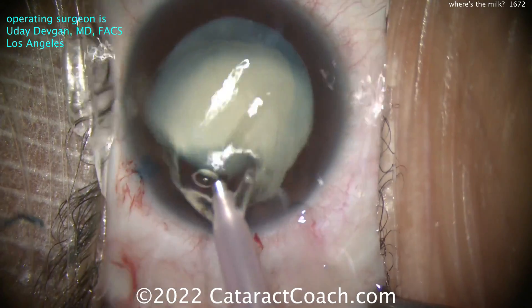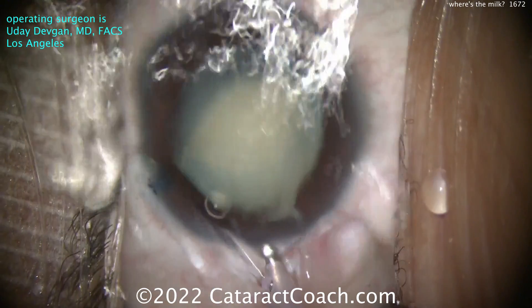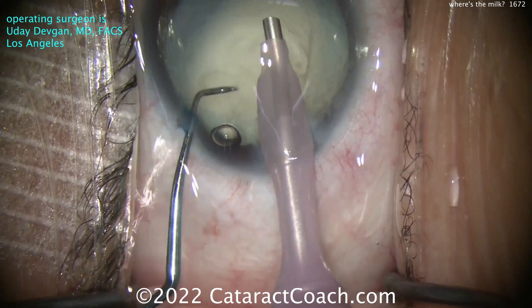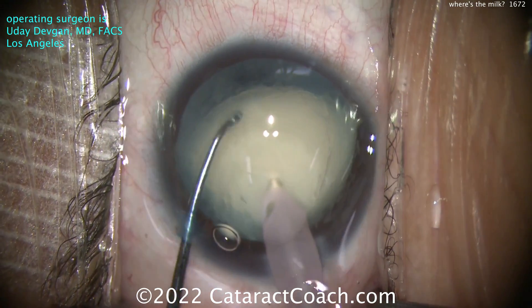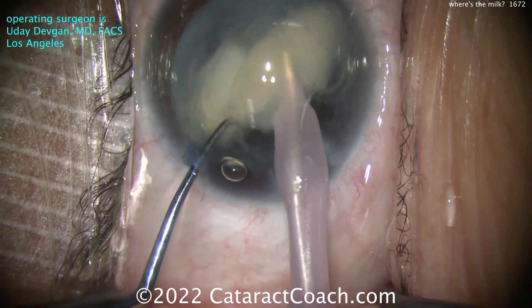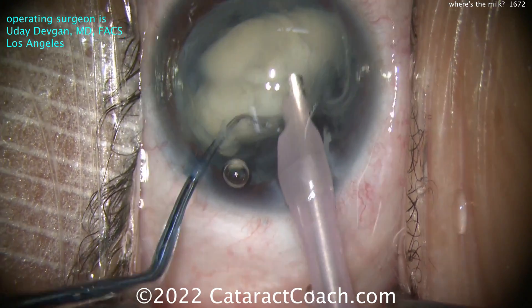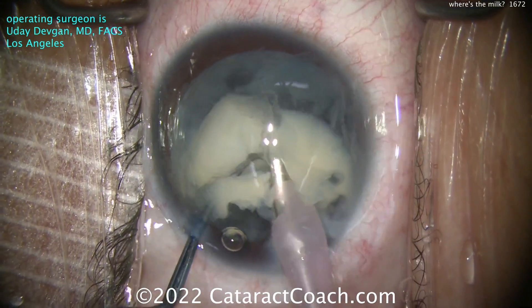The nucleus tilted up like that - I'm going to get that chopper behind it just in case there's a denser thick posterior plate; we'll be able to split that nucleus. Phaco probe going in, chopper on the other hand. Let's get that probe deep into the middle of the nucleus. The chopper has to go around and behind the nucleus - nice and solid, good density in this lens.